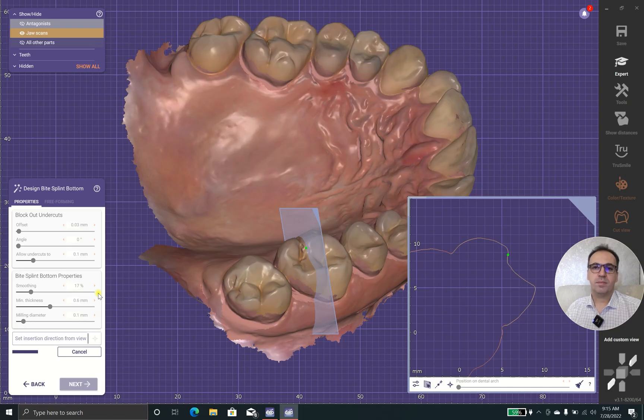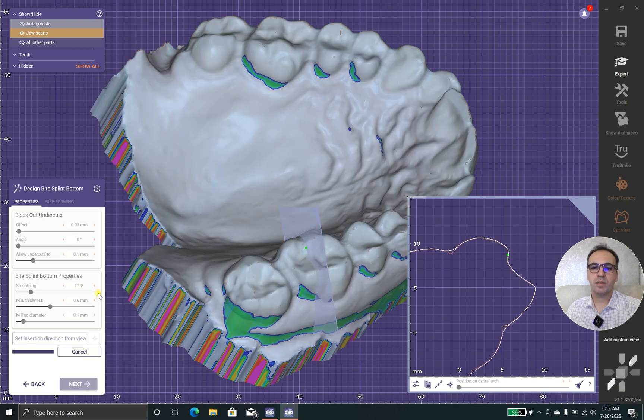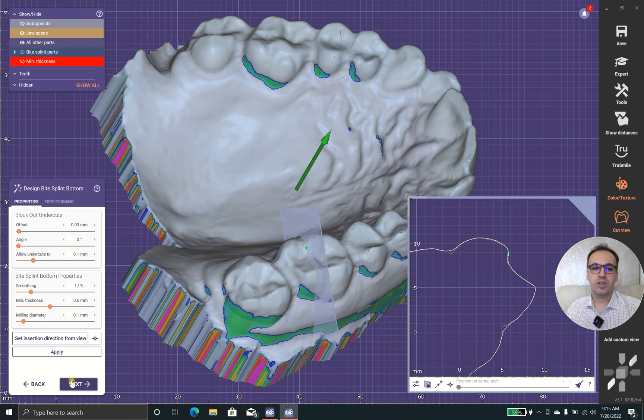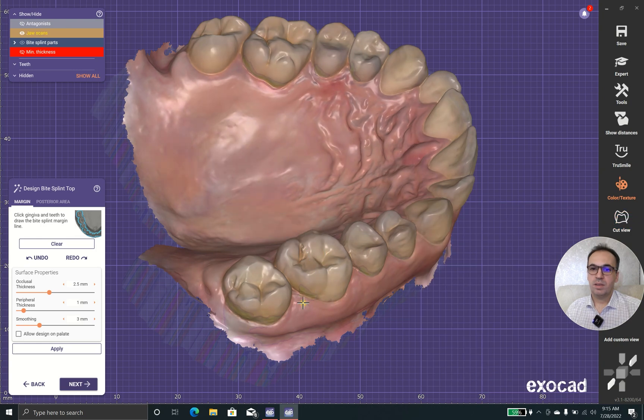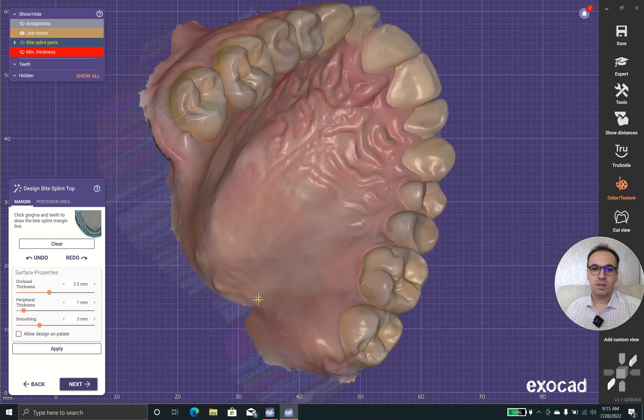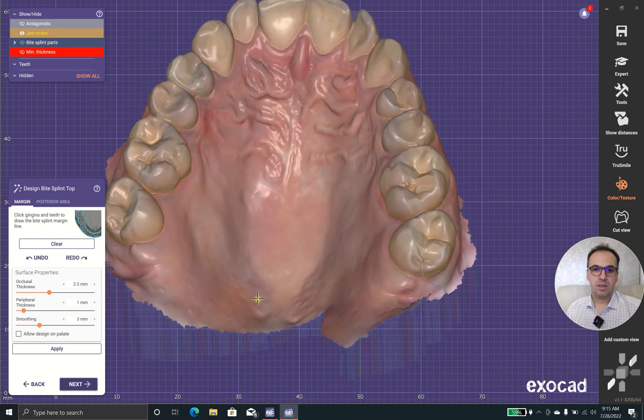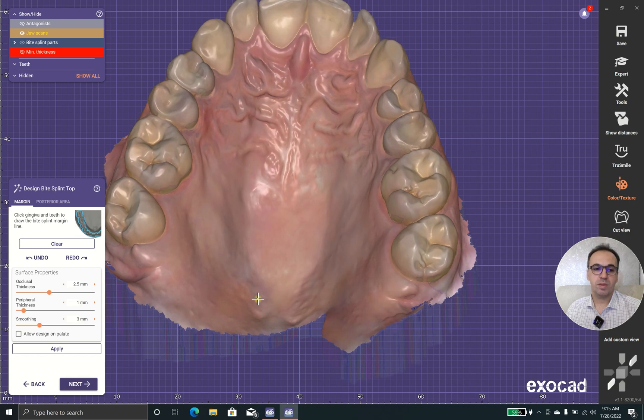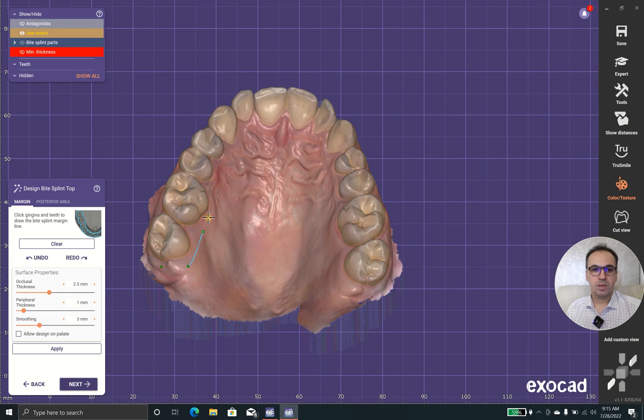You should be aware that these parameters will change how your process works. In this case, the splint will set on the tissue, and now I'm going to design my prosthesis.